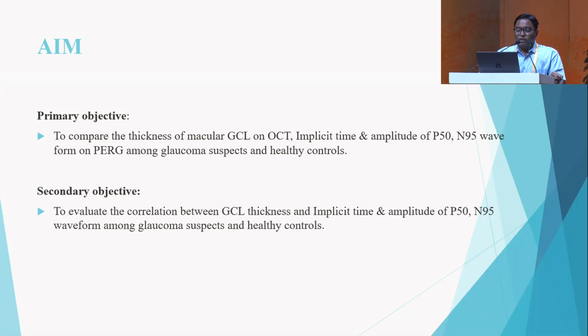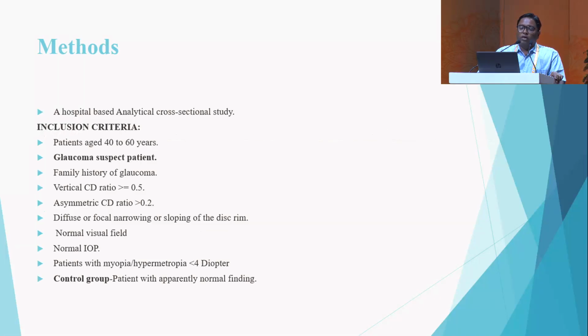Our secondary objective was to evaluate the correlation between GCL thickness and the implicit time and amplitude of the P50 and N95 waves among glaucoma suspects and healthy controls. It was a hospital-based cross-sectional study.